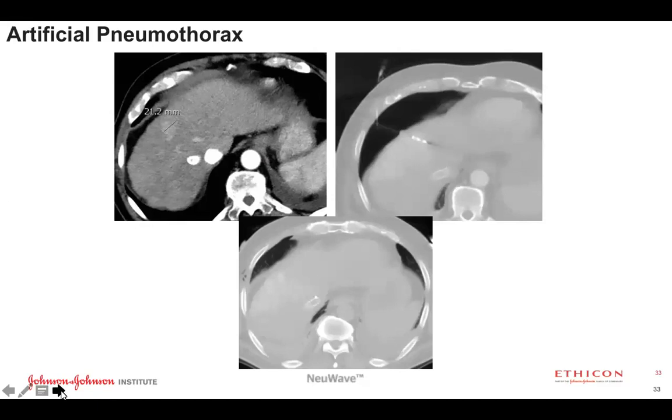Now, what about high lesions? High lesions near the dome. Some people are somewhat intimidated by them. They can be technically more challenging. Actually, the technique of hydrodissection itself was designed to push the liver dome down in order to create an ultrasound window for ablation. That was actually the primary reason that hydrodissection was created, not as a protective maneuver, but as a liver displacement maneuver for more ease of visibility by ultrasound. This was when ultrasound was a primary modality used for ablation guidance.